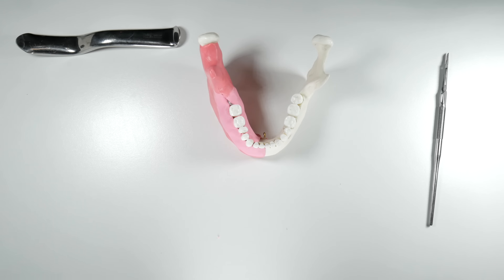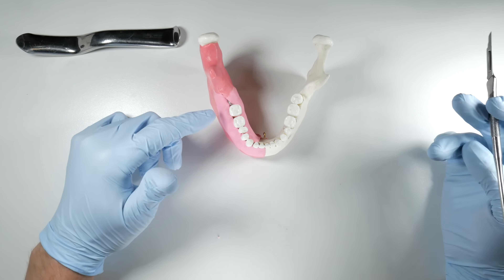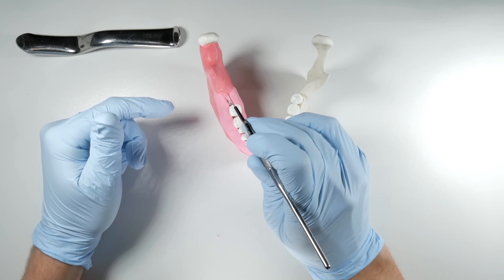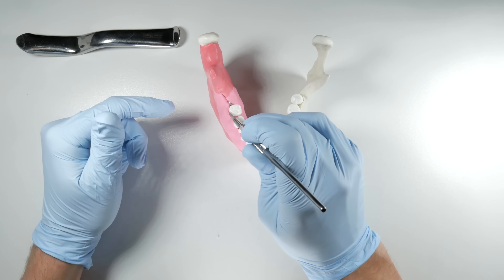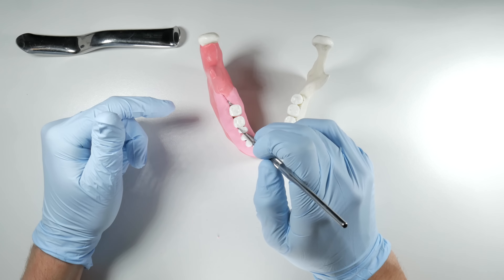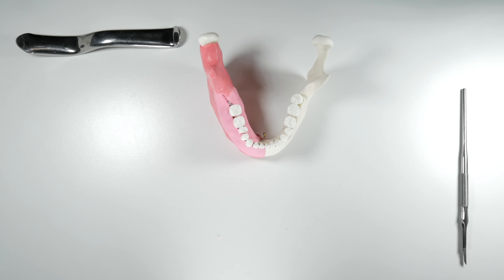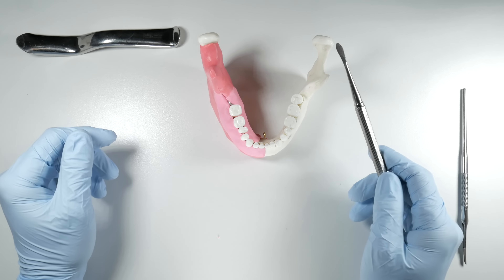When reflecting the flap, I'm going to show you the envelope flap example here. You're going to make your distal incision, trace over it, carry it around the teeth including the papilla in your incision, and then take your periosteal. I can't emphasize enough — you have to have a sharp periosteal.